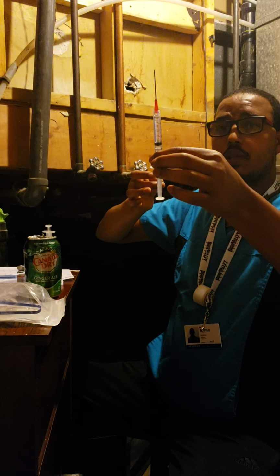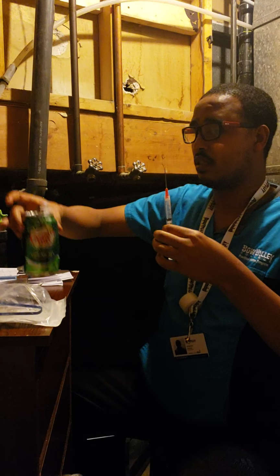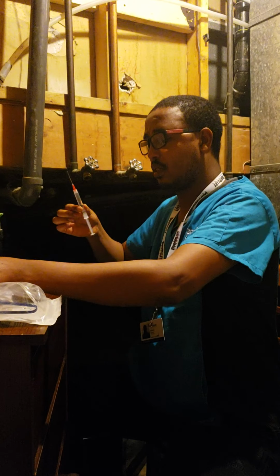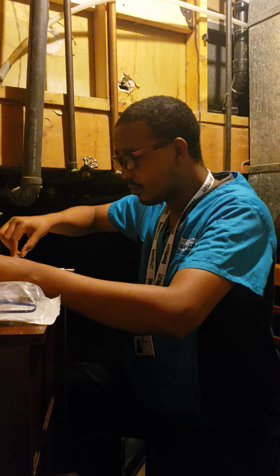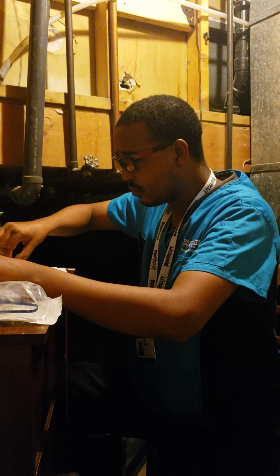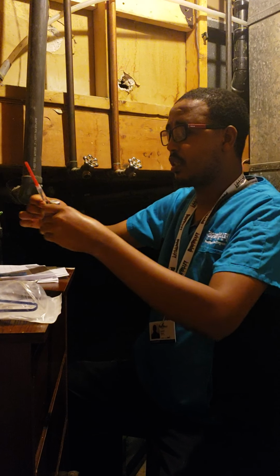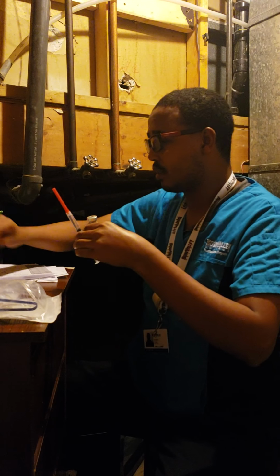Okay, this is 2 ml medication, and I have to recap it and do my second check with the MAR.